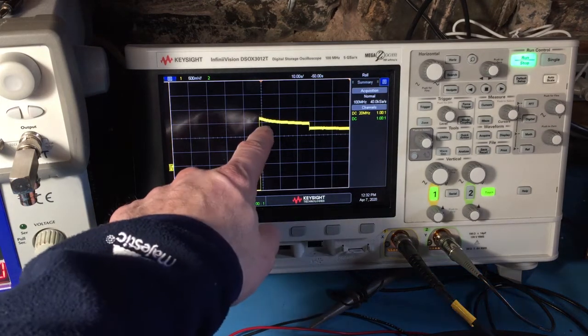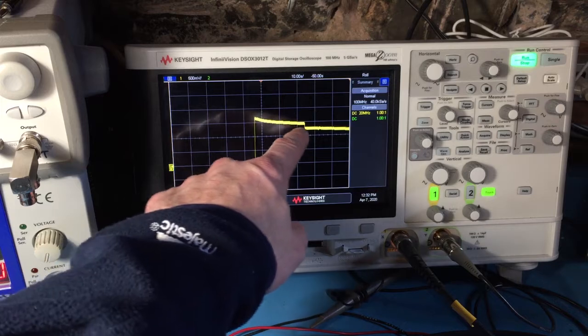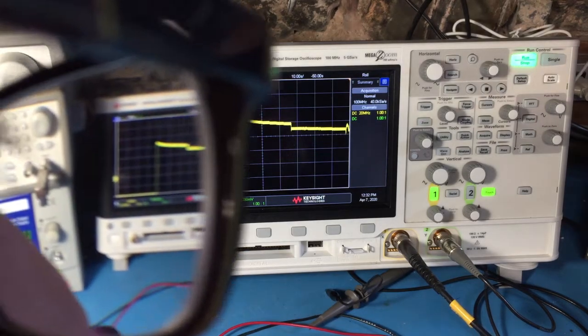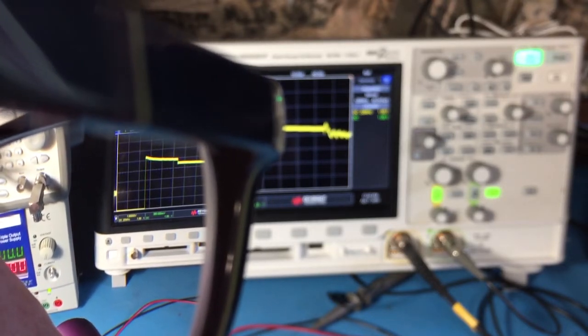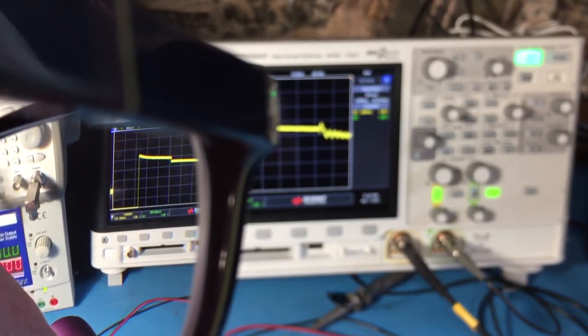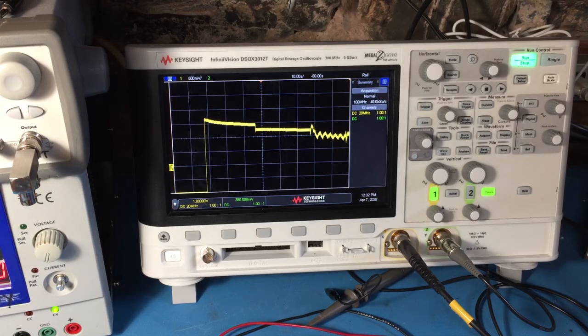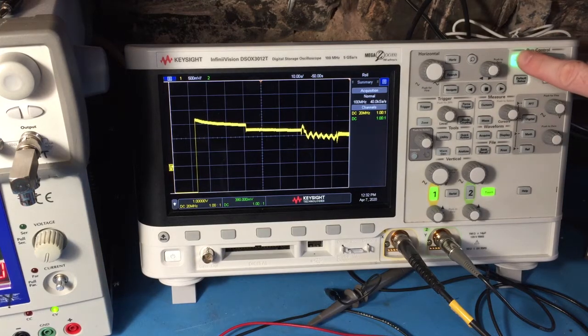And notice how the circuit is still settling down, right? That must have been when I touched something. And let's see what happens if I breathe into it. So just made a few breaths there, kind of sounded like Darth Vader. That's okay though. And I'm going to freeze the oscilloscope, hit the stop button.